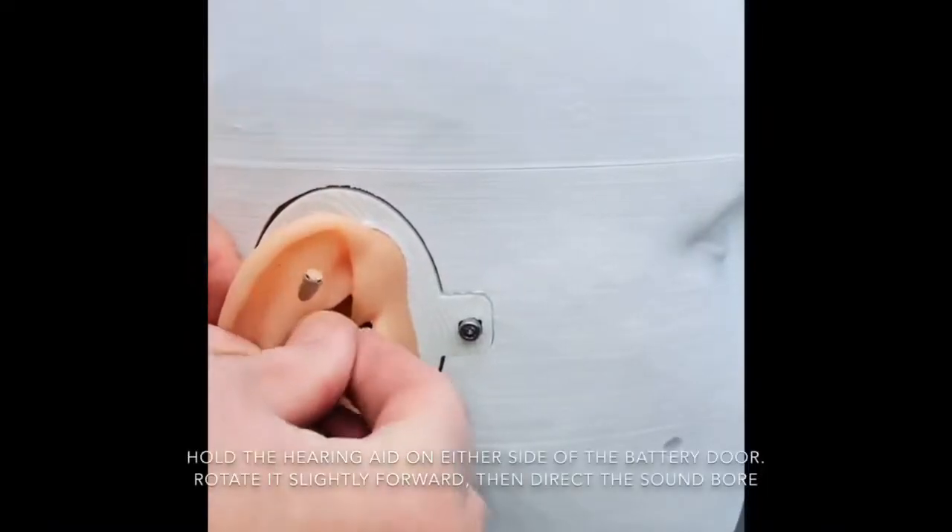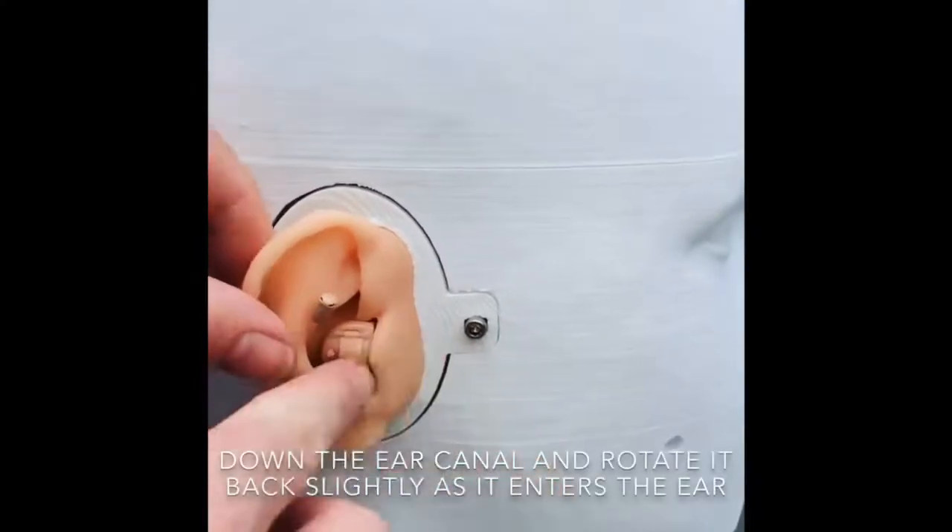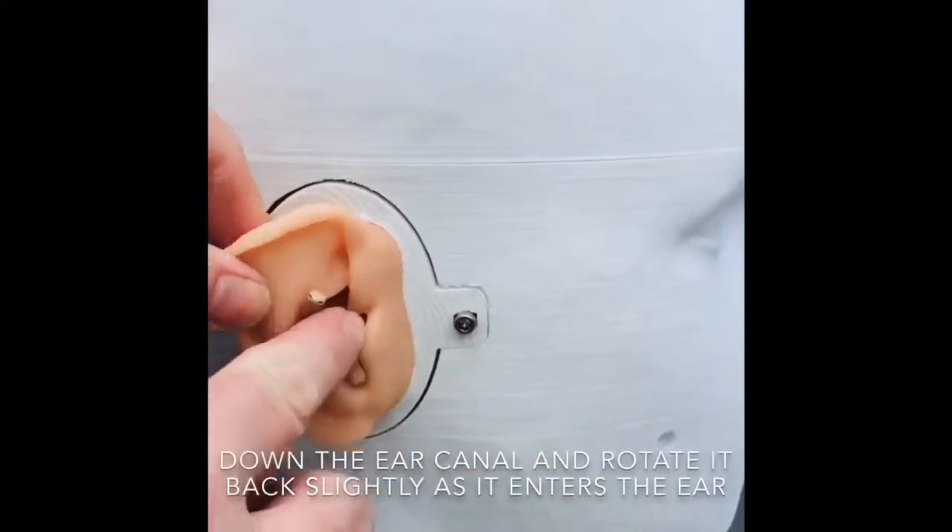Hold the hearing aid on either side of the battery door. Rotate it slightly forward, then direct the sound bore down the ear canal and rotate it back slightly as it enters the ear.